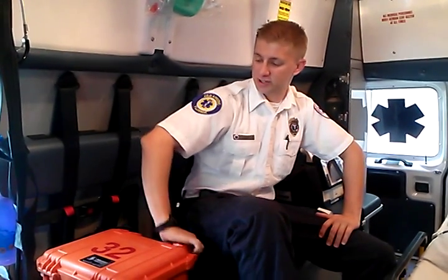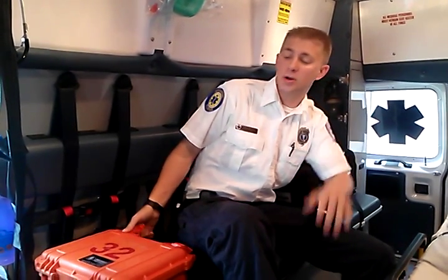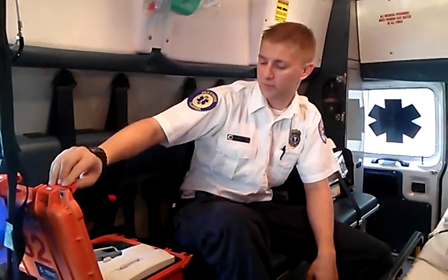FTO Witte here. Going to show you how to work the pumps today. First off, this is just a refresher video. If anyone's already had formal training on the pump, this is not a video to train someone who's never worked a pump before.